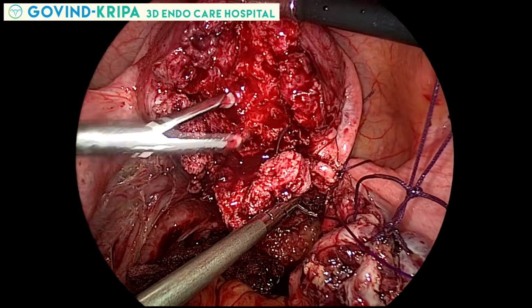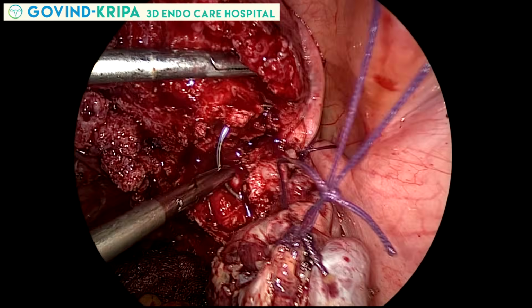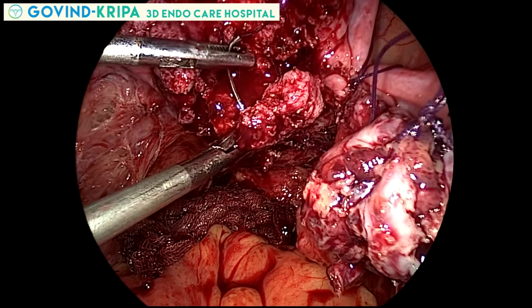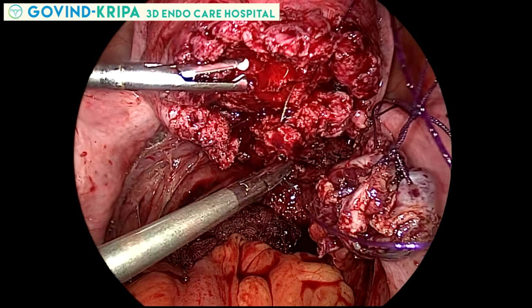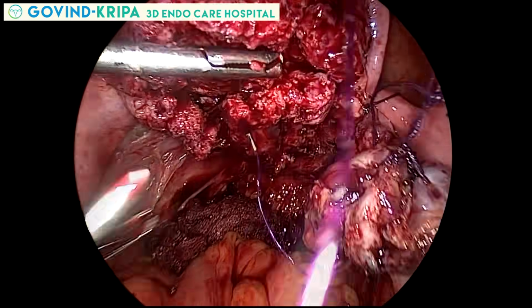There is a particular way of adenomyoma bed reconstruction. The three flaps are not just approximated, rather they are overlapped on each other. For that, one flap, that is lower and right sided flap, is sutured to the adenomyoma bed.